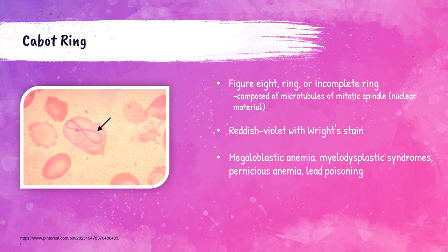This photo shows a great example of a Cabot ring in a peripheral blood smear. Cabot rings are thin reddish-violet rings that appear in loops or even in a figure-eight pattern, caused by the fragmentation of nuclear material within the red blood cell. Patients with megaloblastic or pernicious anemia can have these, as well as those poisoned with lead and those with myelodysplastic syndromes — disorders of the bone marrow that disrupt the production of normal red blood cells. These are actually really rare; I can't think of a single time I've seen a Cabot ring in person working in the field.